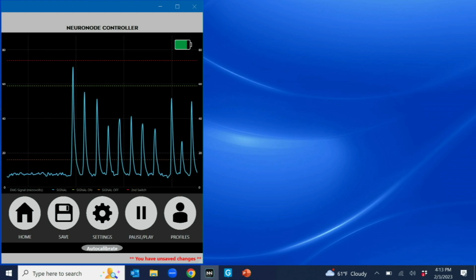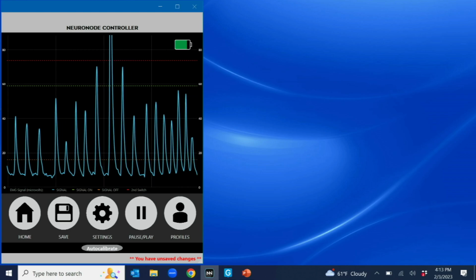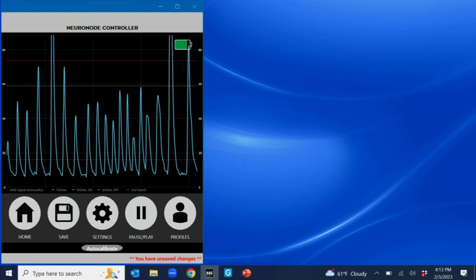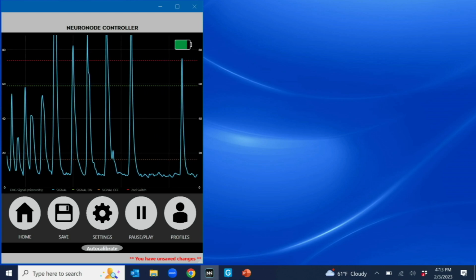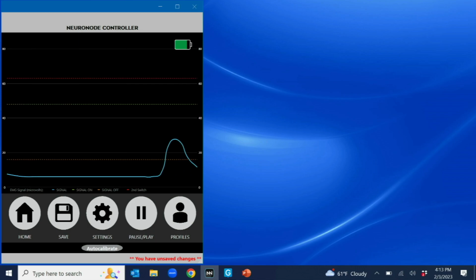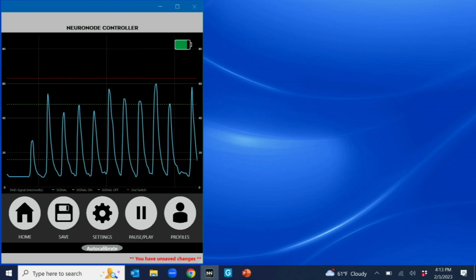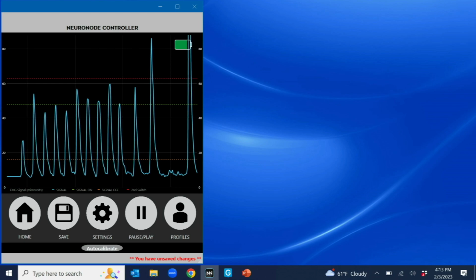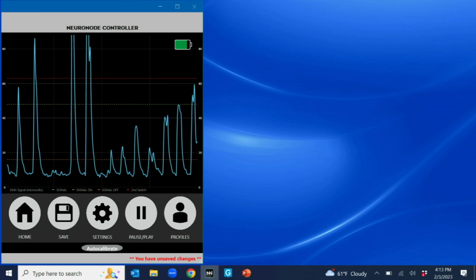So if I'm going halfway, I'm not turning it on. Correct. These peaks are not being seen as switches because they have to go above the green line and then come back down below here. So I could say, oh, if it looks like consistently she's hitting in the middle here, I could just go in and adjust my signal on to be lower, and then she wouldn't have to go quite as high. So it's all very flexible based on the needs. It's just in the calibration phase that you have to do that fast. In the calibration phase, at least that's what it seemed like was working here.